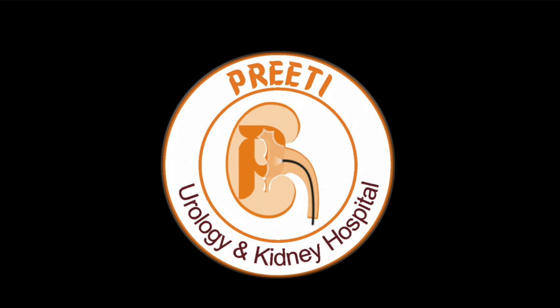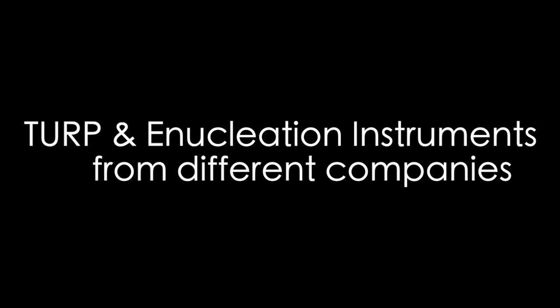Here is a video of different company TURP or enucleation of the prostate instruments: outer sheath, inner sheath, working element, and working element with laser bridge of different companies like Storz, Wolf, and RK Medical — showing different sizes, different mechanisms of laser fiber insertion and telescope insertion, and their sizes.